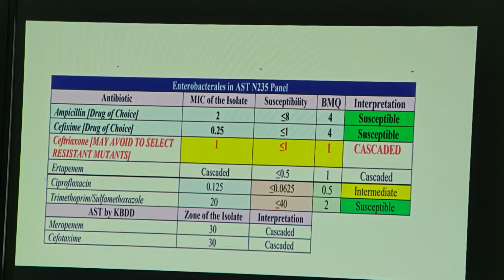This is very important, as sir mentioned in our workshop also. Even though the drug of choice for Salmonella in Harrison and other textbooks is mentioned as ceftriaxone, when we analyze the MIC and the breakpoint, nowadays ampicillin has become susceptible, because for a while we didn't use ampicillin. That may be one of the reasons. And the mutant selection window also we have to check. The MIC in this case, you can see, is 1, so that is a weak breakpoint. If you use ceftriaxone at that particular amount, it will not cover the MSW of that particular variant. So in this case we particularly mentioned it. Last week also one case we discussed.